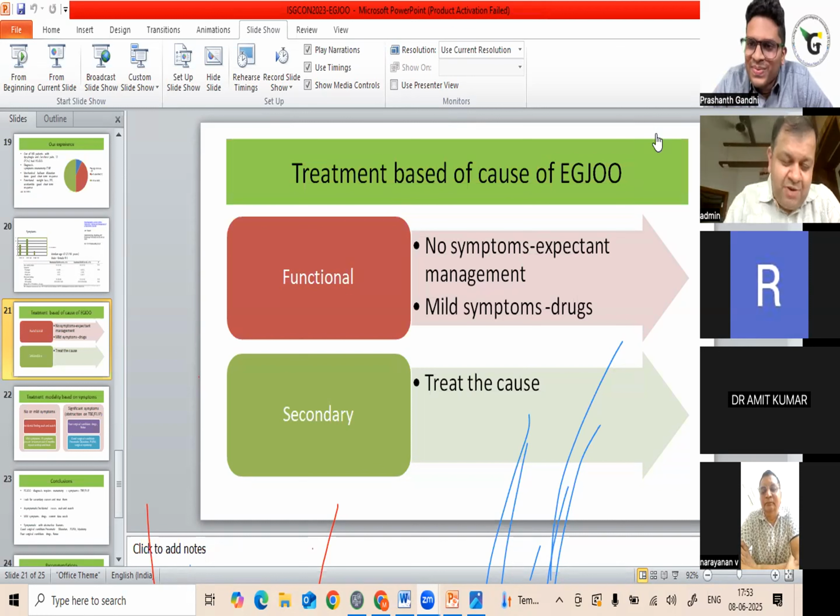And like I told in my presentation, I would advise everybody to start using timed barium esophagogram in clinical practice. Just prime your radiologist. You just need 3 pictures clicked at 1, 2, and 5 minutes. It's a very, very useful test. We do not have FLIP available in India. So timed barium esophagogram really makes your life much easier. You are able to show the patient that there is impaired relaxation and there is delayed clearance of the esophagus, and then we can go ahead with definitive treatment. So it's a simple test.